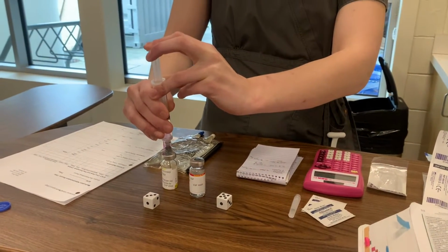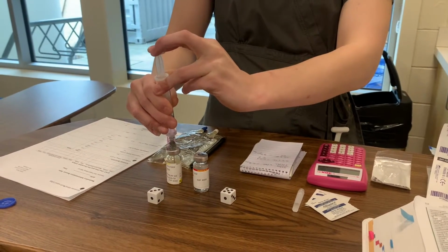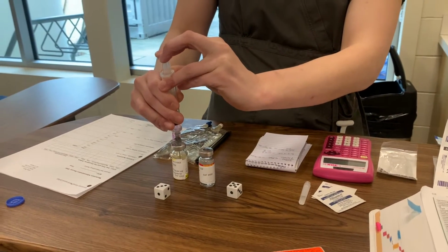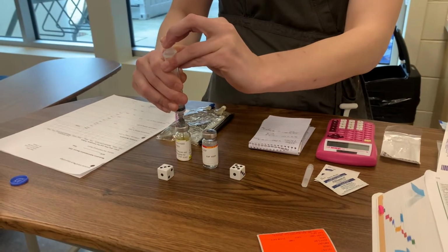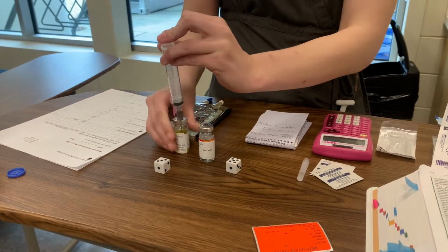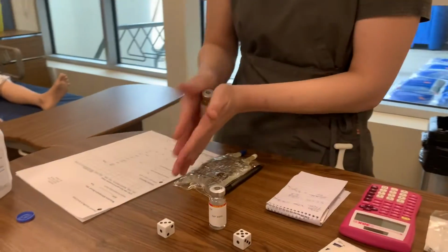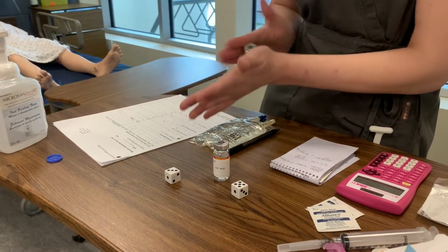Going ahead and getting all those 8 milliliters of water in there. Perfect. And then I'm going to go ahead and roll this so we can get all the particles mixed up in there.